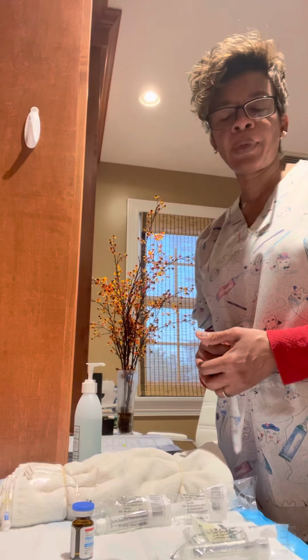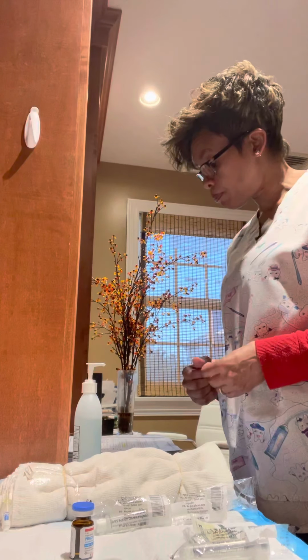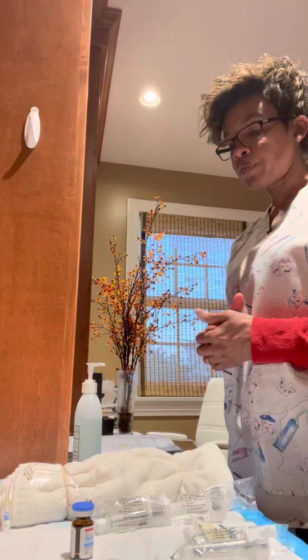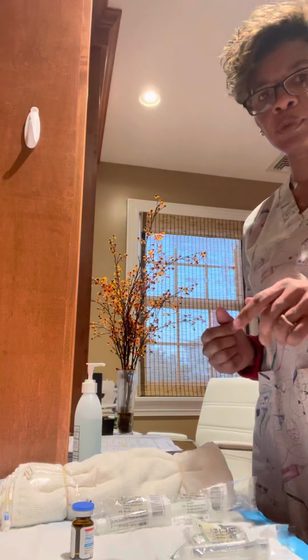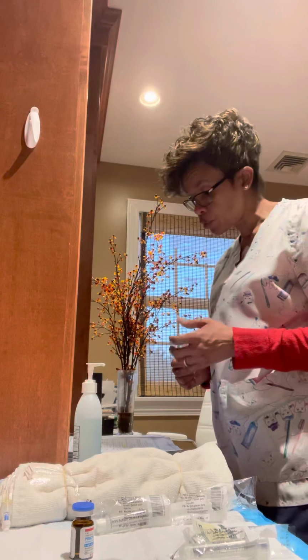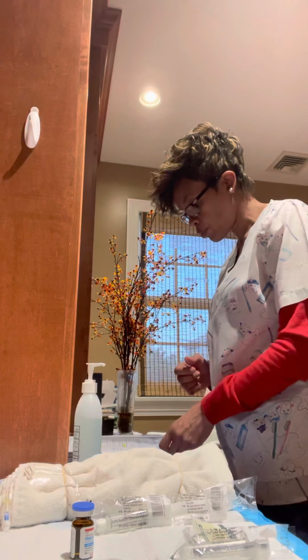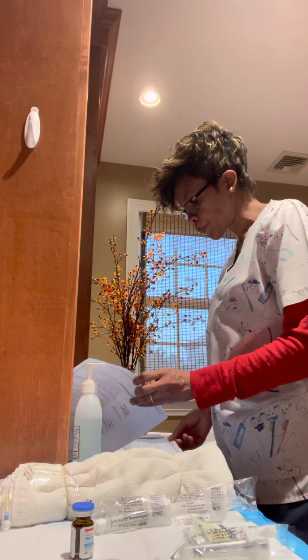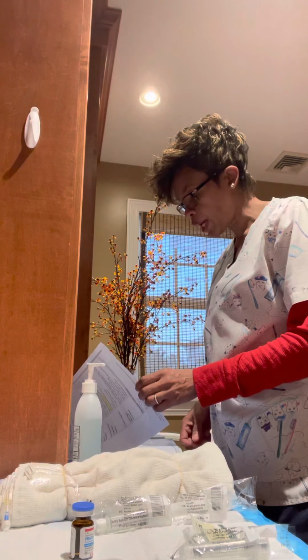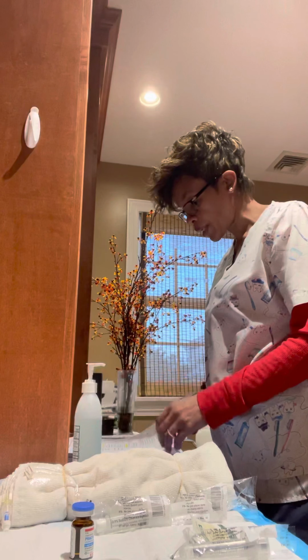My name is Farah, and today I'm going to be giving medication to Miss Mary Edwards. So first thing I want to do is to review the doctor's orders, and it does say Mary Edwards with a date of birth of 2/2/40, and she is to receive bumetanide 0.5 milligrams IV push over 60 seconds.